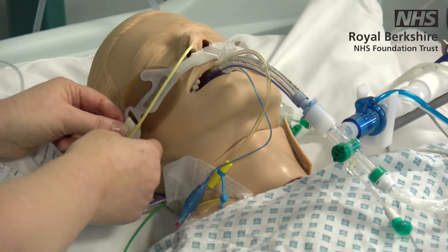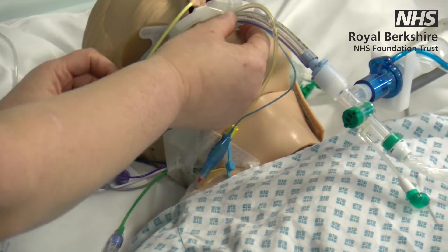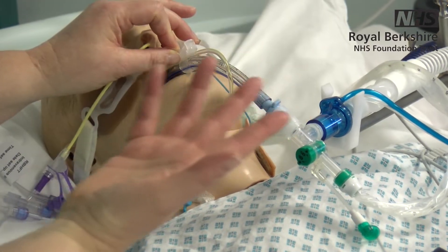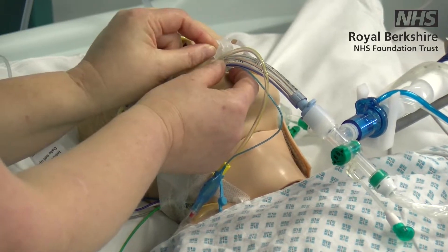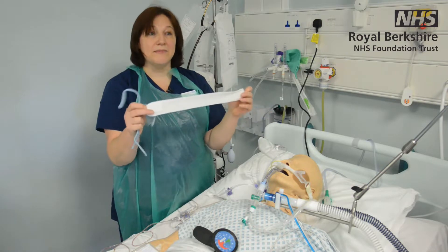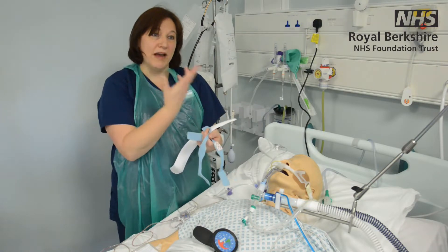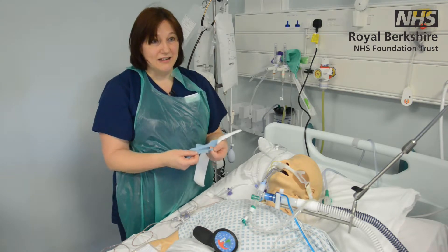The tube will be attached with various methods. In this case we've got an anchor fast, which keeps the tube quite secure without causing any pressure damage for the patient. If we needed to change this, I would do that with one of the intensive care nurses — it's certainly a two-person job. Some patients you might see use different ties or tapes, again to avoid pressure damage. They're soft and interchangeable so we can change them as they get wet or dirty, but always do it with an ICU nurse.